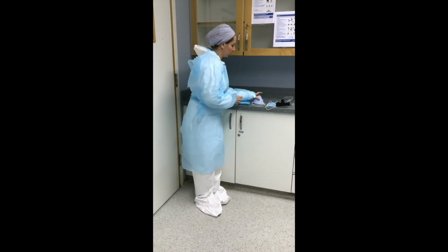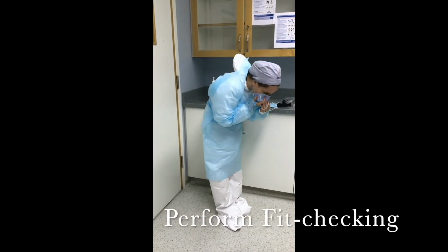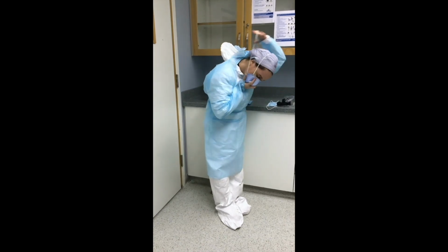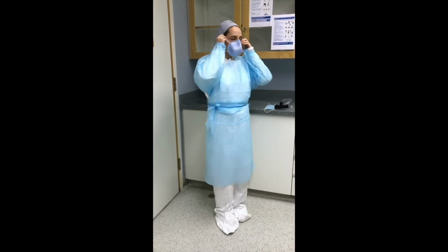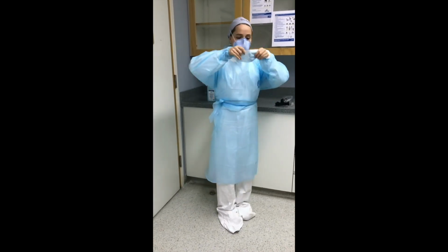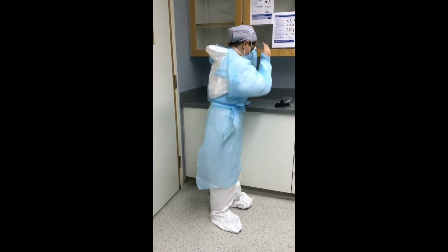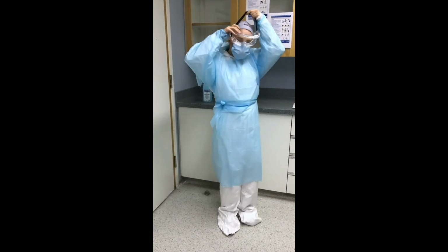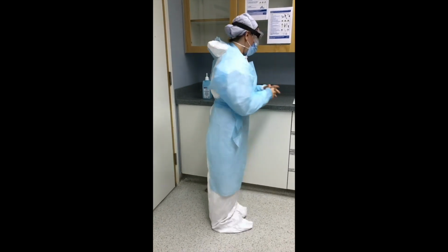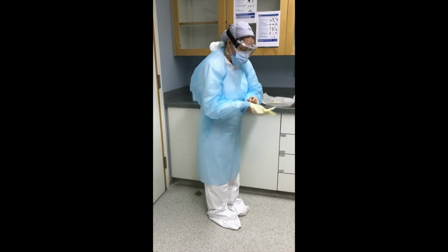Next, apply your N95 and perform the manual fit test. The upper strap should be above the ear, the lower strap should be on the neck. And then apply another face mask above it. Next step is wearing the eye protective shield, the eye goggles. The last step is wearing gloves. It's preferable to double glove at all times.